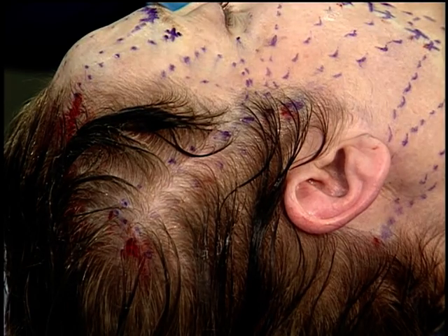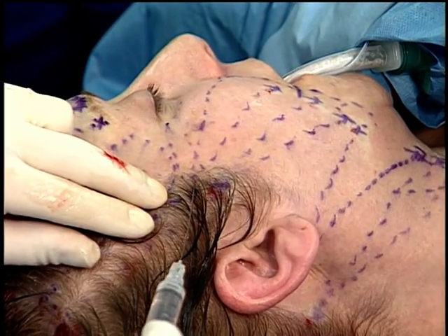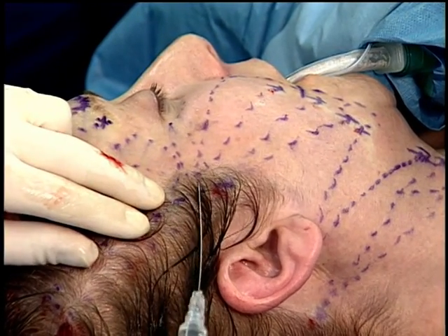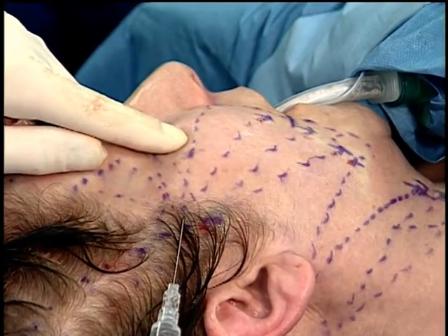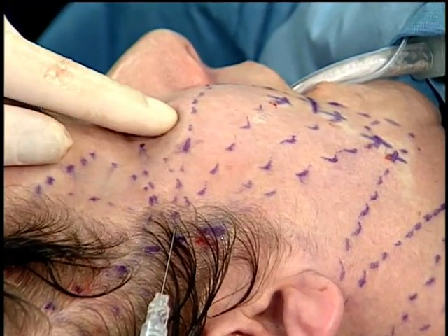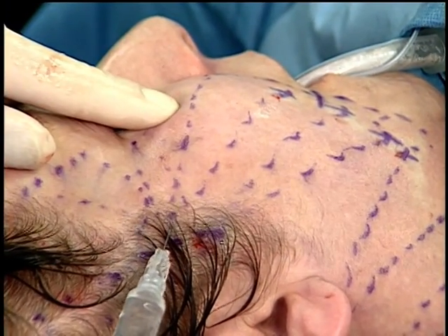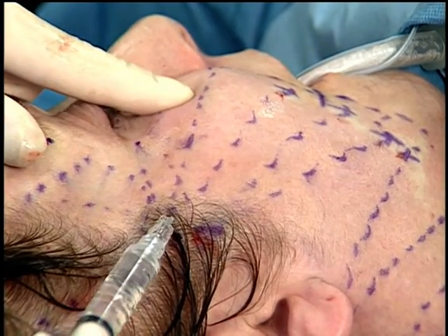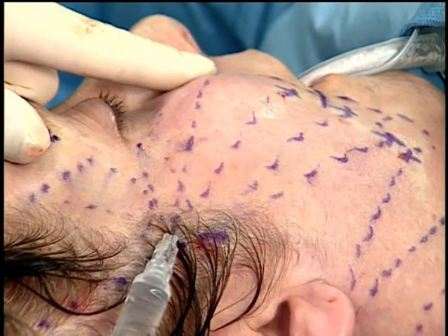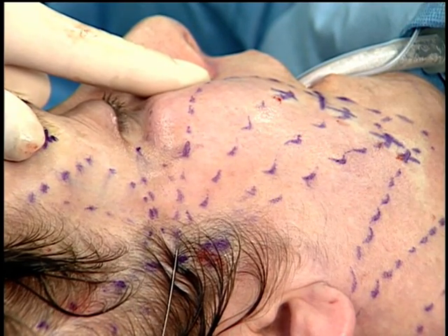Now we're going to go out onto the face with our N loop lifts. And we're going to go in through our deployment port and our anchor port and slowly, slowly advance, each time injecting about 0.1 to 0.2 mils of solution. I'm in that nice buttery fat plane, and I don't advance the needle till I've hydrodissected the fat off. As I get to my exit point, now I'm going to inject and hydrodissect and distend with 2.5 cc's of fluid.